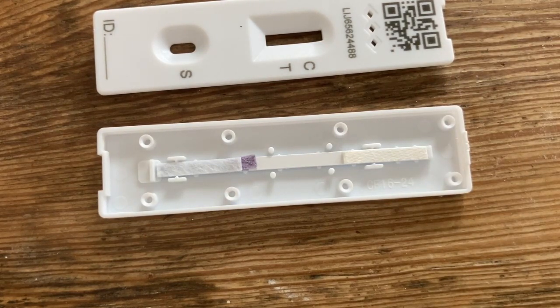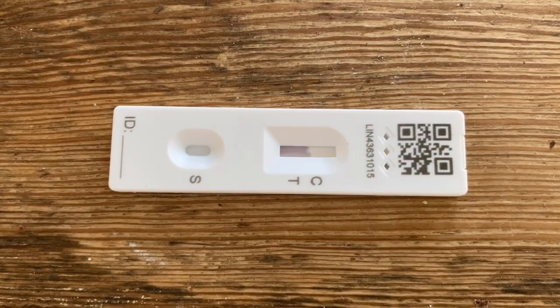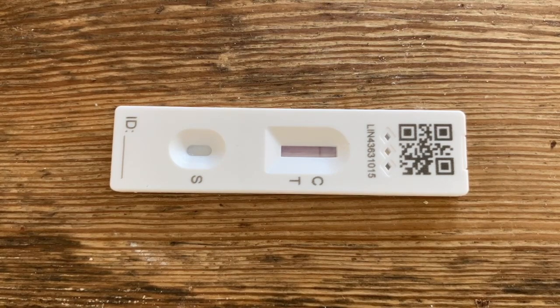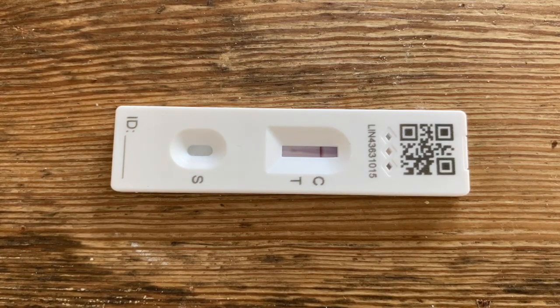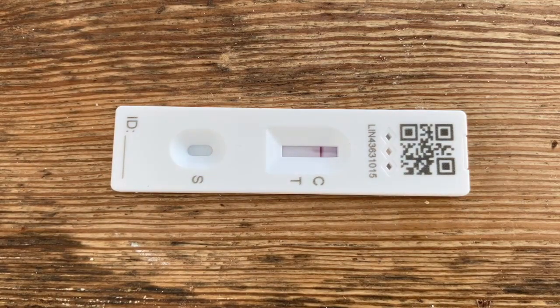So let's have a look at how that looks in action. We deposit our sample at the S window, it quickly wicks up the device, picks up those gold labelled antibodies, and that then appears as a red smear in the second window. Any gold labelled antibodies that are attached to a virus stay at the T line. All the rest carry on moving and then get trapped at the C line — that's a concentrated line of gold labelled antibodies. The remainder carries on up the device and gets deposited on a pad at the end, underneath the QR tag.